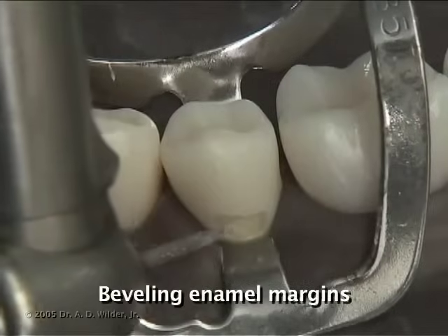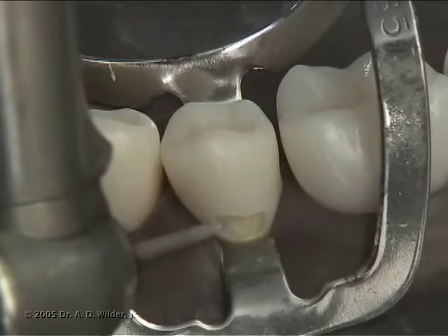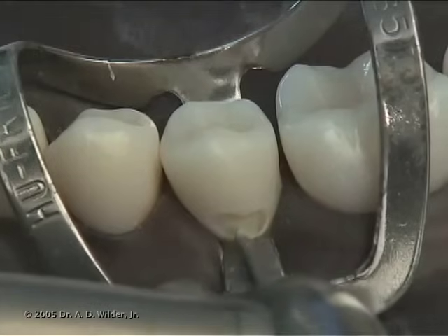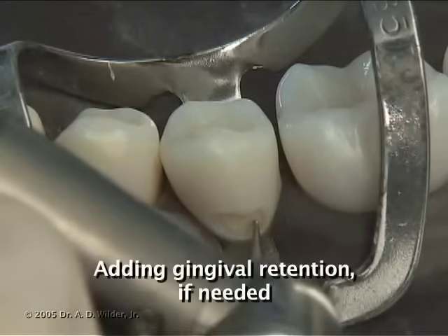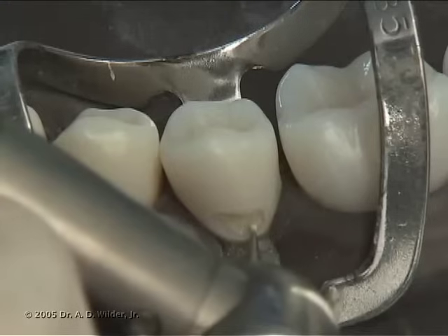Bevel all the enamel margins except the gingival margin with a tapered diamond. You can, however, remove unsupported enamel from the gingival margin as shown here. Retention grooves are important for class 5 preparations since they are subject to greater tensile forces.